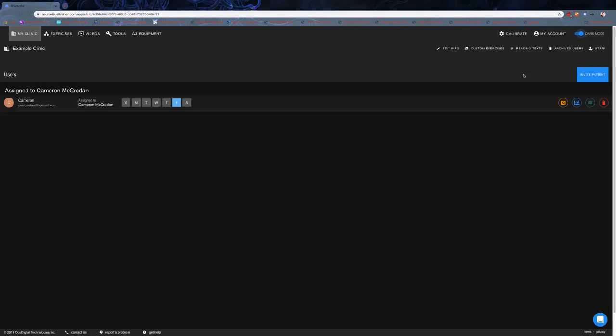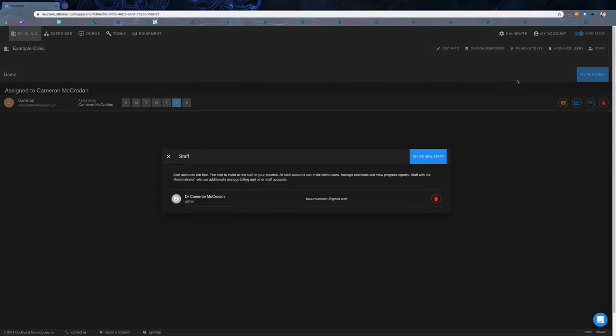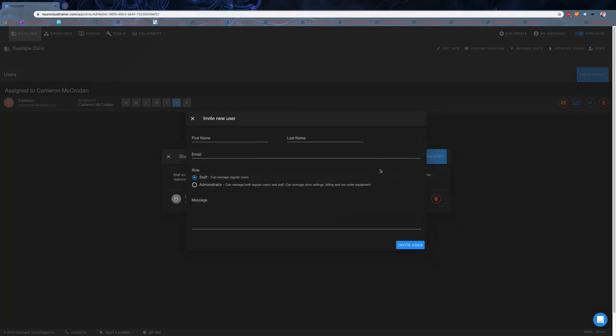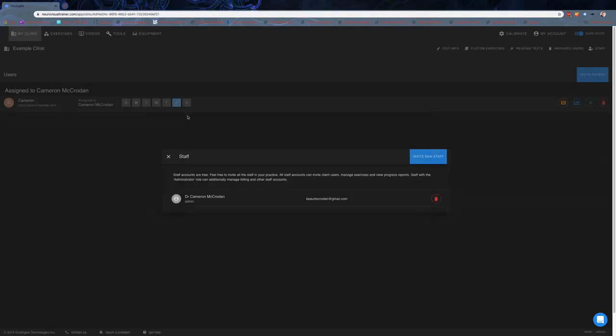The next thing a lot of you are going to want to get into right away is adding your staff. Click on the staff button, you can invite new staff whether they're staff or administrators, and you can get them all set up on there.